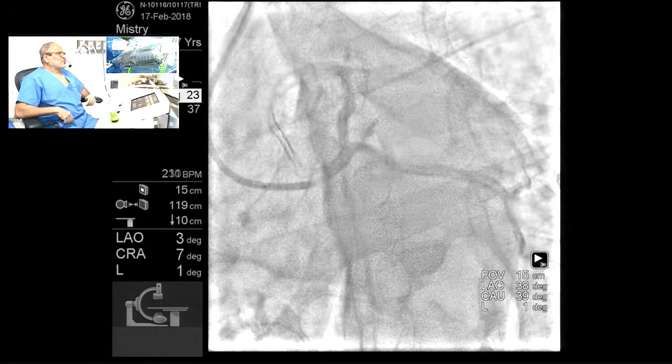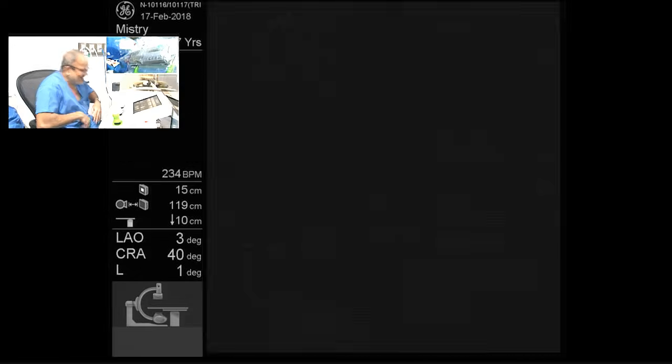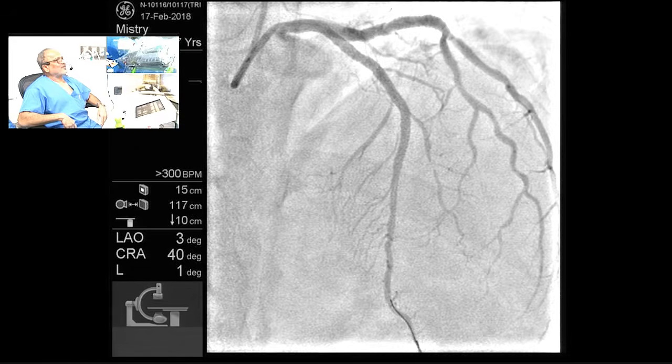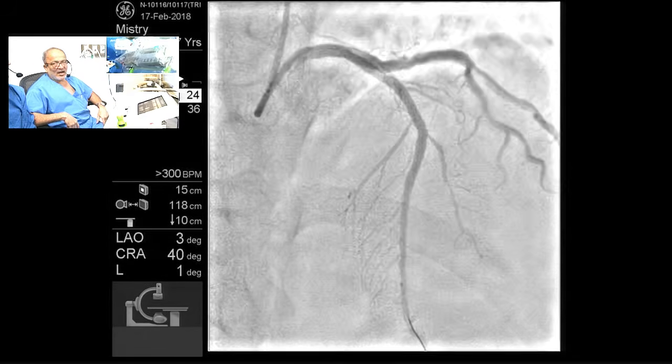Now please don't prompt me to do anything. Enough. Robert is tired. Yeah, record. Yes. This looks great. One AP caudal.